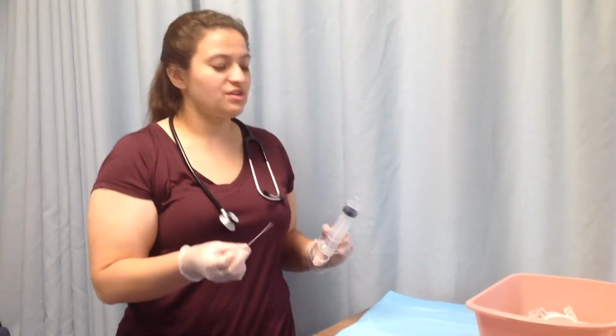So now that I have my pH strip, I would also look at the stomach contents to make sure that it's normal color, so usually straw color. Make sure that there's no blood. If there's any odor that I can smell, document any abnormalities.